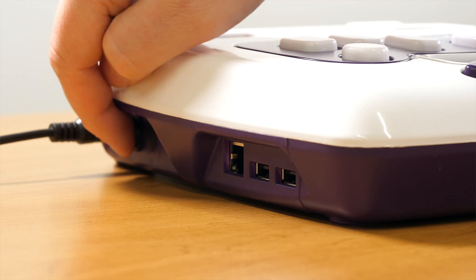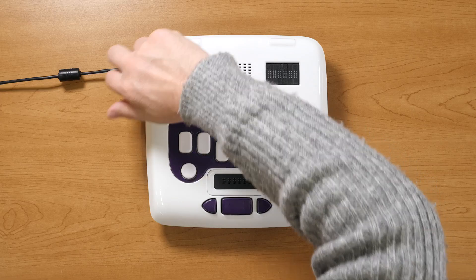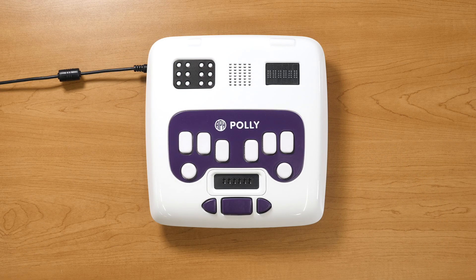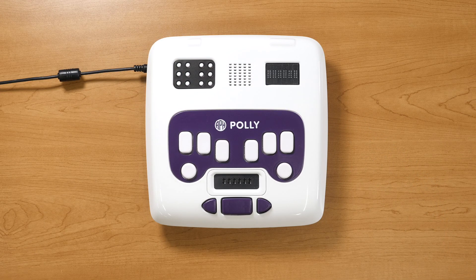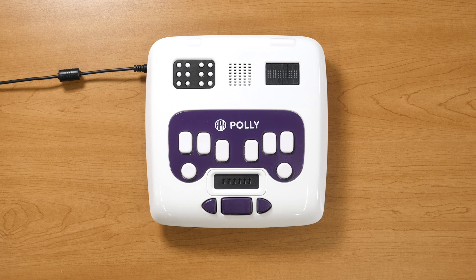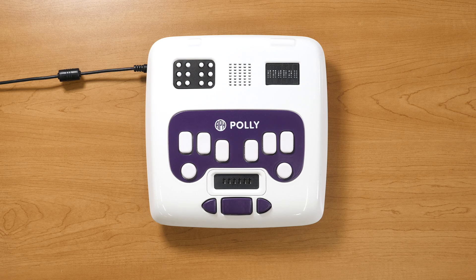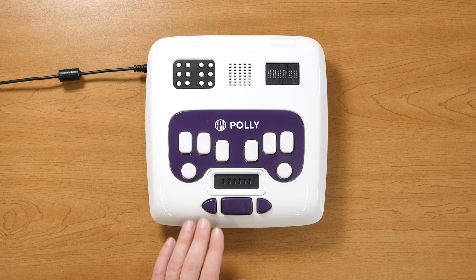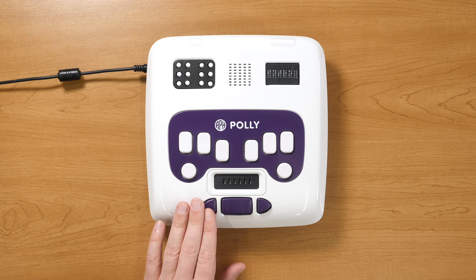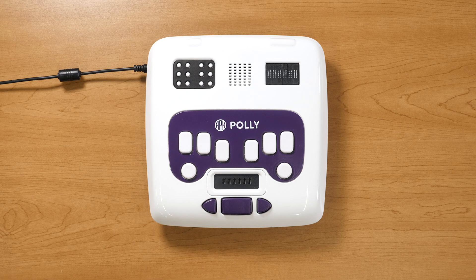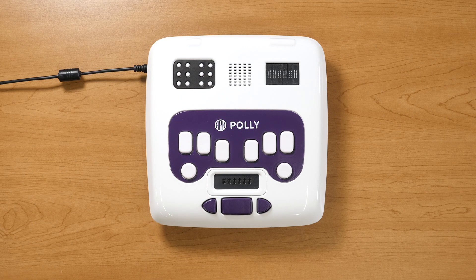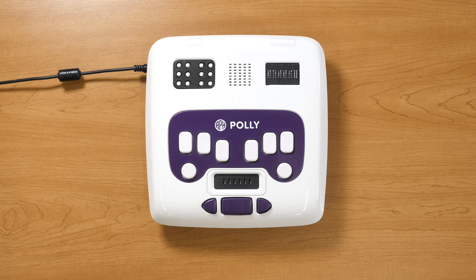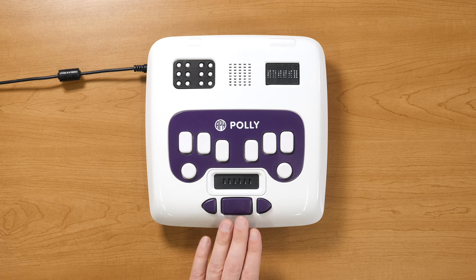To enable, turn on your Poly and after it starts up, press the left arrow to go into Settings. Next, press the space bar to select.